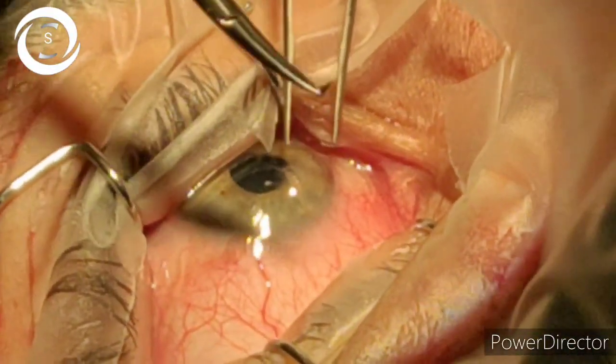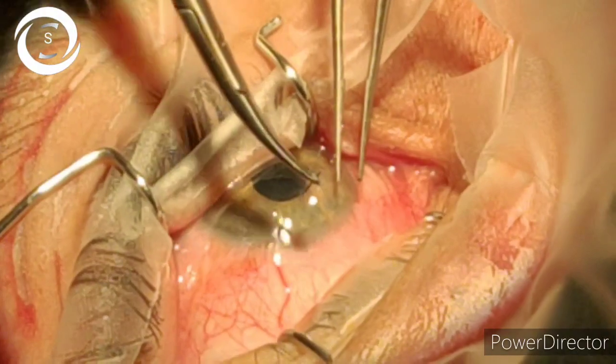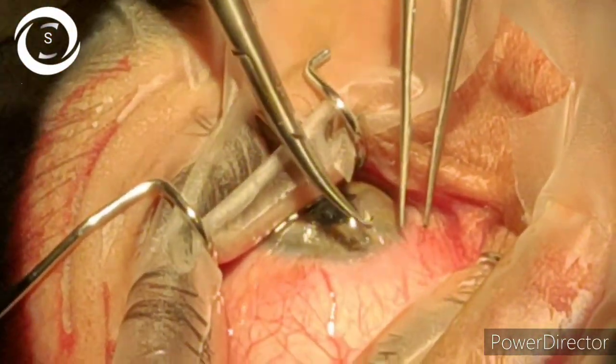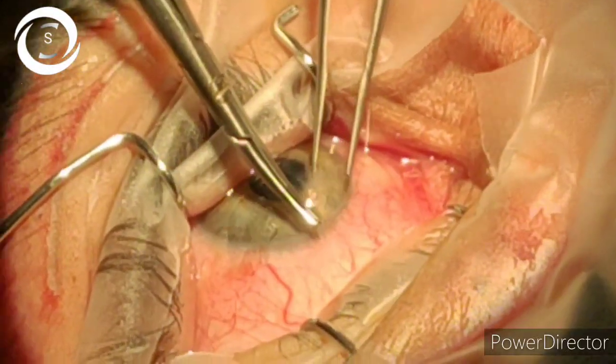The patient was very cooperative, so I decided to perform it under topical anesthesia. Ideally it should be done under general anesthesia, and you have to avoid local anesthesia because of the fear of extrusion of the intraocular contents, as intraorbital pressure is raised.